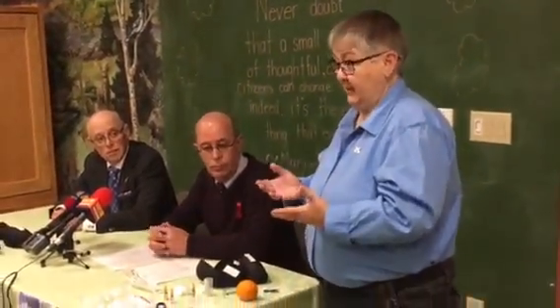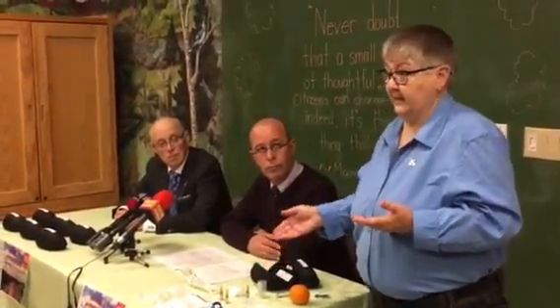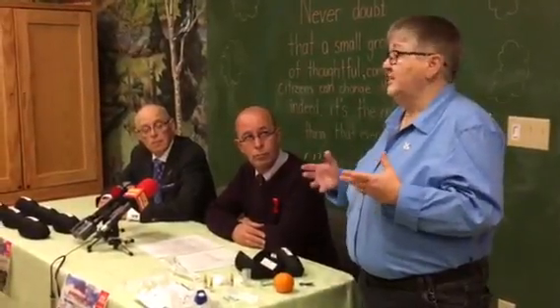And then when they come around, they're going to be really confused, and there's 2 possible scenarios. One is that they're going to be very happy but they won't express it right away because, like, what just happened? I know I did my drugs, and it's going to be very cloudy for them. So you're going to want to talk to them, explain what just happened. You overdosed. We shot you with naloxone. You're going to be okay. Depending on what the person did, if it were fentanyl, for instance, you probably would need the second one. And it's really important to call 911 because with some of the new designer drugs, as the minister referred to, we don't know how strong they are. And it's always, always important to call for help to try and keep the person from passing away.